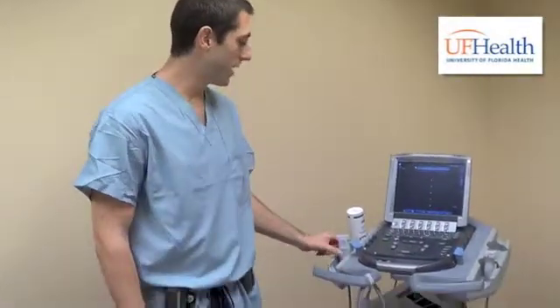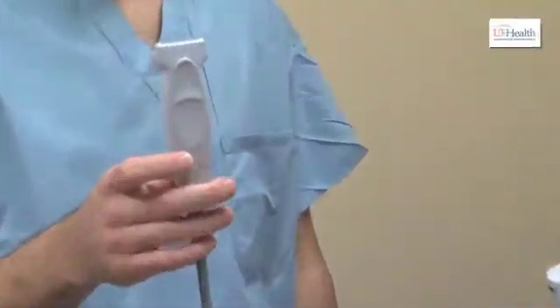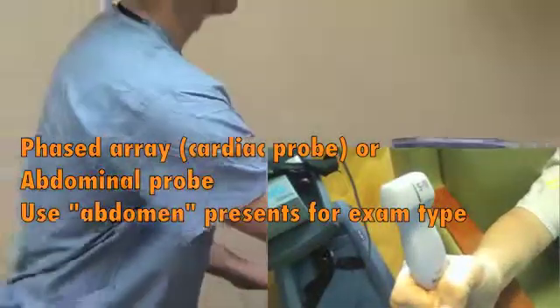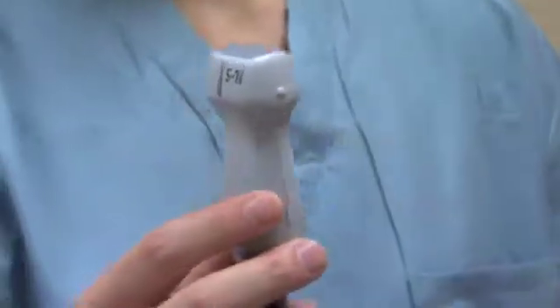First, let's talk about the ultrasound in general. This is called a linear probe. This is used for superficial structures — we sometimes use this to look at the pleura on the lung — but a better probe is the cardiac probe, which is over here. So generally we use this cardiac probe. This is helpful for more deep structures.